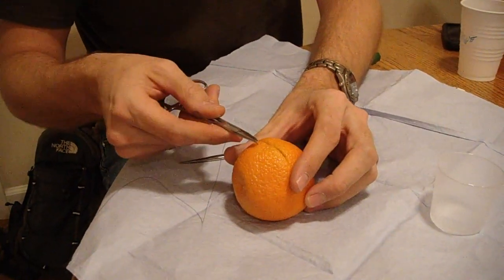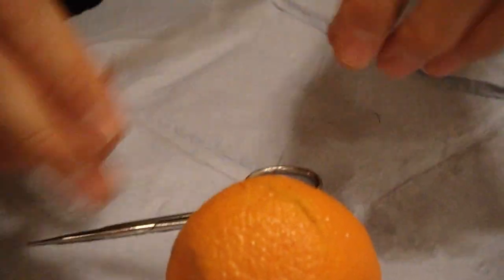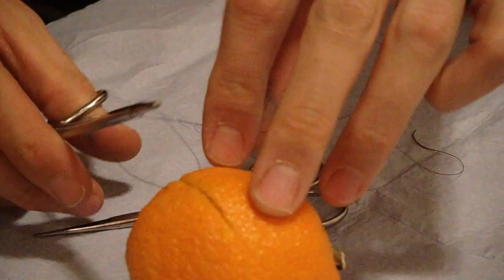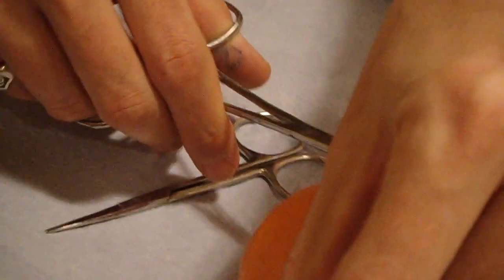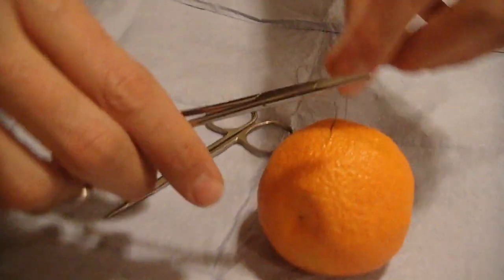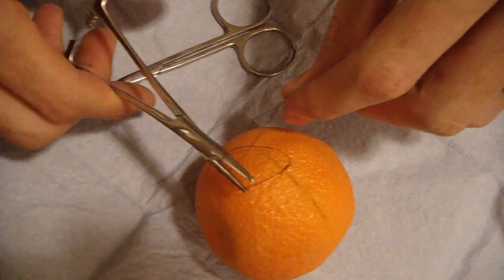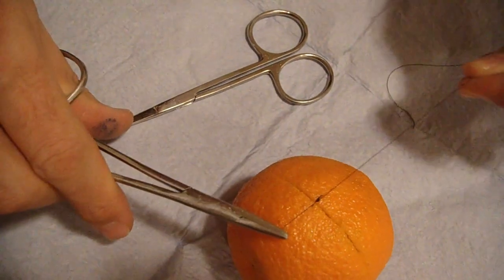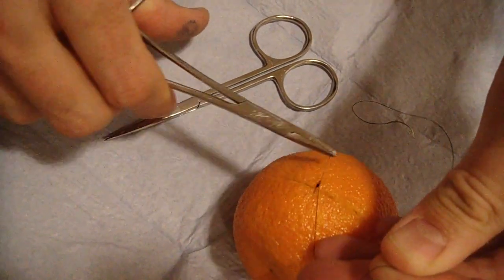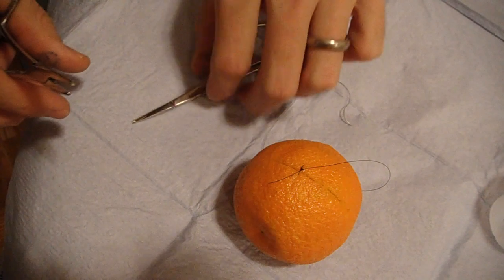I usually start in the middle of a wound. I'm going to go about a half centimeter out. Two wraps, and just grab the other side, almost perpendicular with the pulls. So the opposite side that it starts on, that's where it should end up — the single string will end up over here. After about five of those.